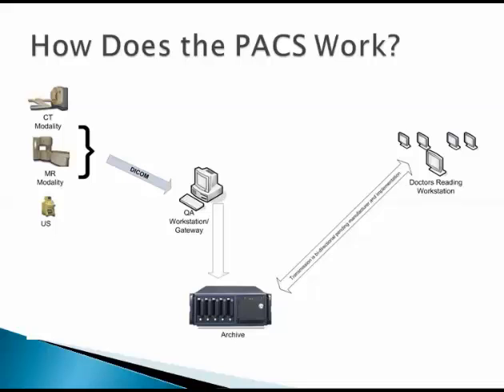Once the QA workstation validates all of its information, and usually you have a technician doing that, it goes over to an archive where the image is stored. Next, you have the doctors or the radiologists using what we call reading workstations. Again, they're high-level monitors to review the image, pinpoint, and annotate on it, and at the same time they're dictating a report usually, or writing a report. They can either type a report, or some use Dragon software to dictate a report as well. So I hope this visual image helps you.